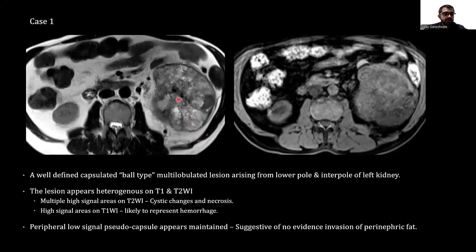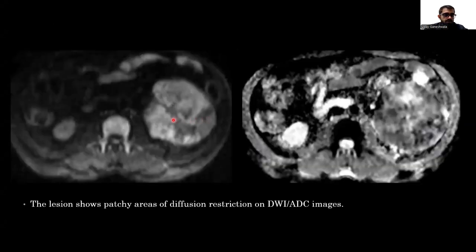Now let's start with the cases. We can see a well-defined encapsulated ball-type multi-lobulated lesion arising from the lower pole and inter-pole of the left kidney. The lesion appears heterogeneous on T1 and T2-weighted images. Multiple high signal areas on T2-weighted images represent cystic changes and necrosis, and high signals on T1-weighted images likely represent hemorrhage. Peripheral low-signal pseudo-capsule appears maintained, suggesting no evidence of invasion of perinephric fat. The lesion shows patchy areas of diffusion restriction with low ADC values on DWI-ADC images.